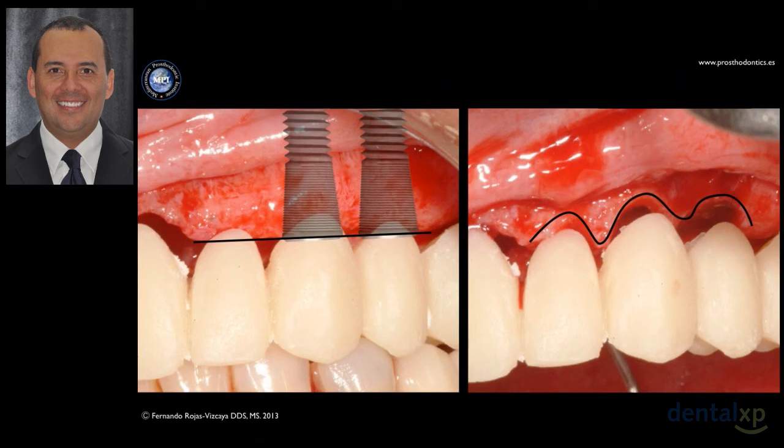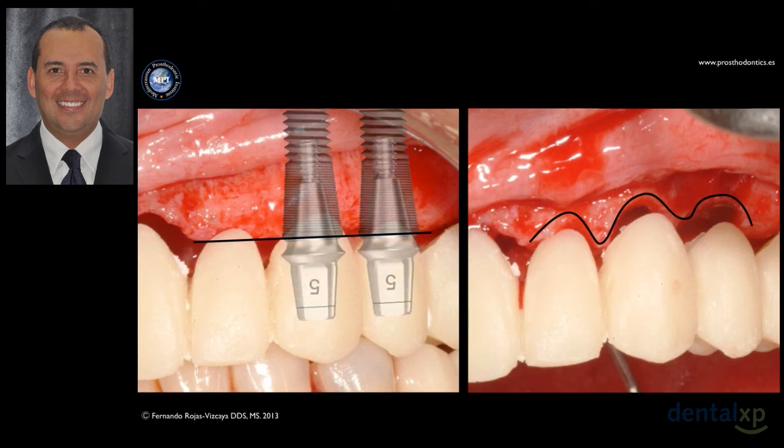But imagine that you place the implant just surgical-guide-guided. This means that you place the implant in a correct mesiodistal and buccolingual position, but you place the implant where the bone is, so at the level of the bone. Now you will connect your abutment anyway, right? The occlusal plane needs to be the same in both cases, left and right.